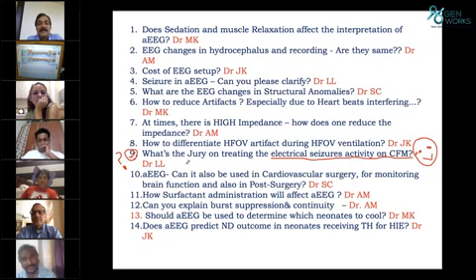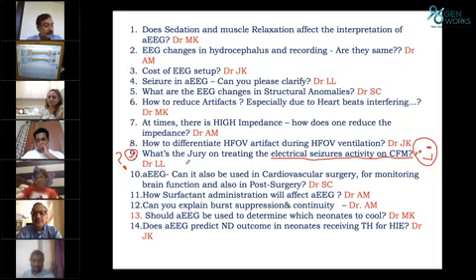Somebody has asked how long it will work after giving the anticonvulsants. Sir, if you give benzodiazepines, up to 1 to 2 hours; in a term baby, the normal activity will come back in 2 hours, some babies 3 hours. Suppose it is a preterm baby, up to 6 hours. But after 6 hours, it should come back to normal. If it is not, and there is discontinuous, burst suppression or continuous activity, some pathology is going on. Look for seizure or something else. That is the reason AEEG is very significant in this.